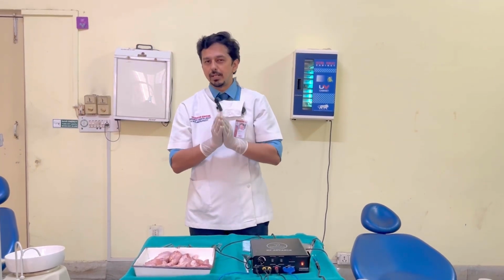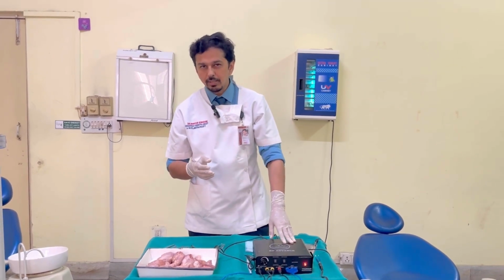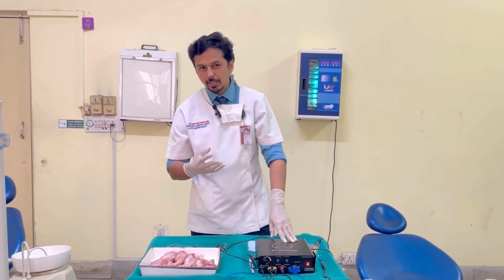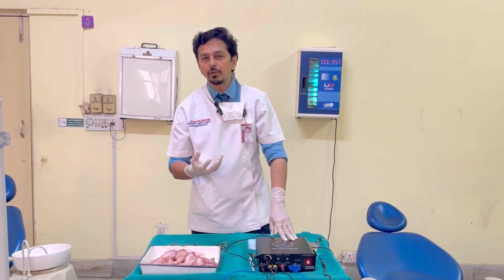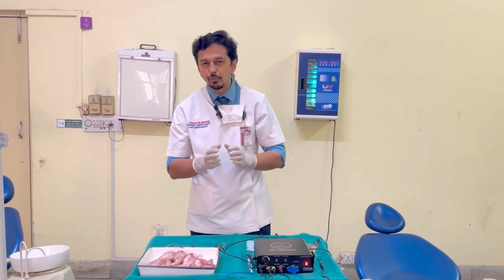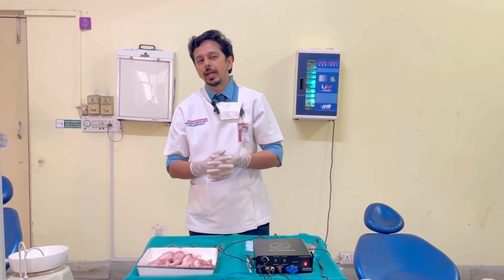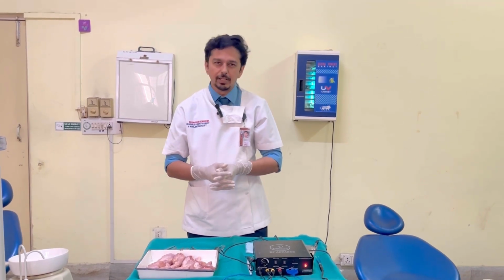Basically, anesthesia is required. Post surgery, whenever you are using a thermal modality, since the modality is cutting by heat generation, burning of the tissues, the amount of inflammation, edema, pain, etc. would be more as compared to a blade. So post-operative anti-inflammatory drugs are definitely required.